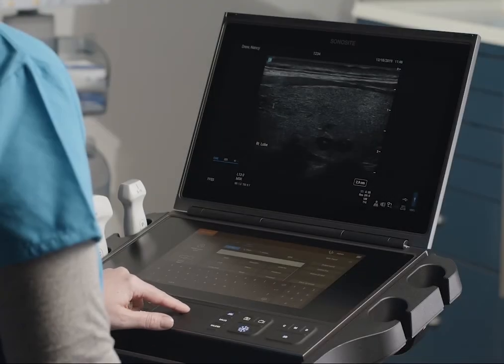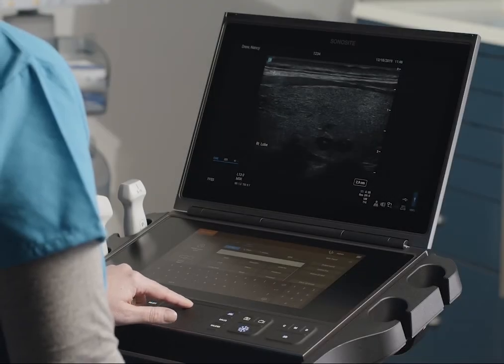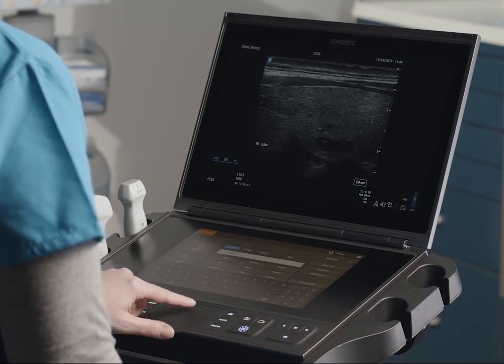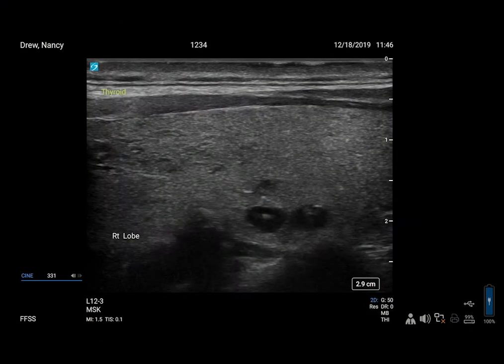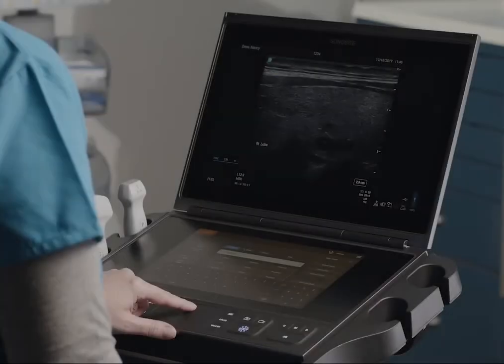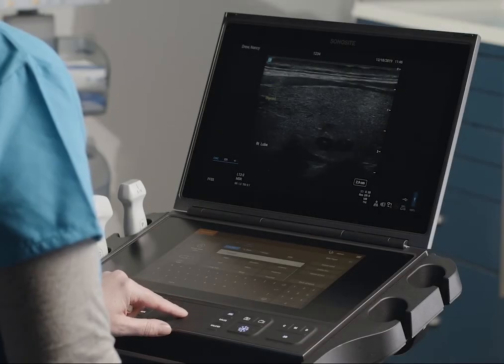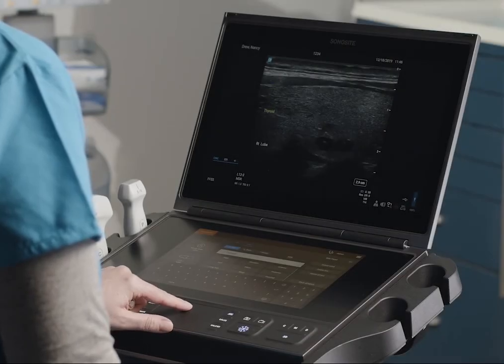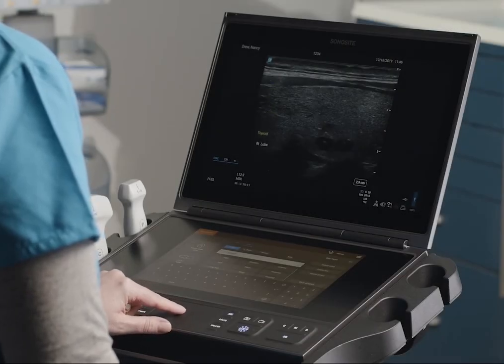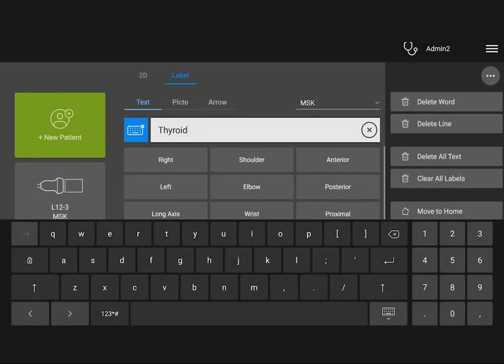First, select your label by moving the cursor over it and pressing the Select button. The selected label should now be highlighted. Now let's move your label. While the label is highlighted, you can move it using the touchpad. You can also edit it in the text box.